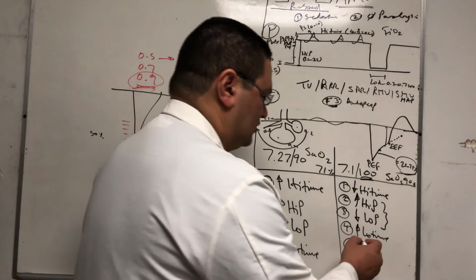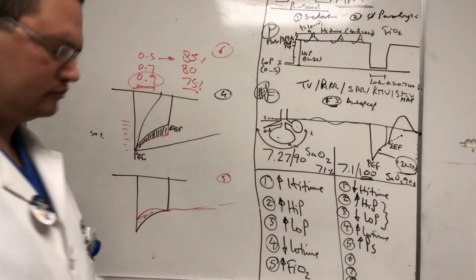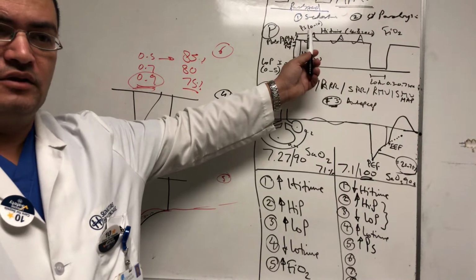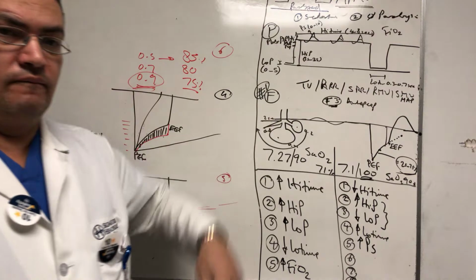So increase the pressure support. We never touched the pressure support, right? Pressure support, if you increase it, it will improve all of the small breaths, right? All of these small breaths will actually be bigger. And this is APRV, not bilevel.